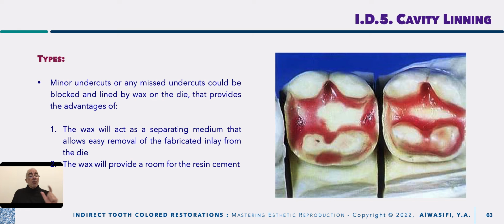That's why we need to treat this surface; we cannot treat it as being composite and then cement it immediately without treatment. No, it needs to be treated to remove the traces of the oil film, and at the same time try to compensate for the missing or deficient free radicals of your fitting surface.